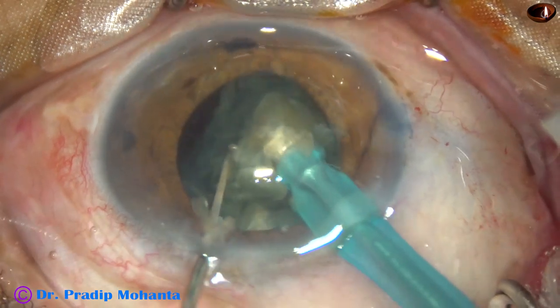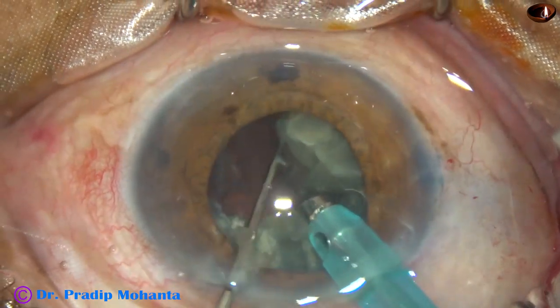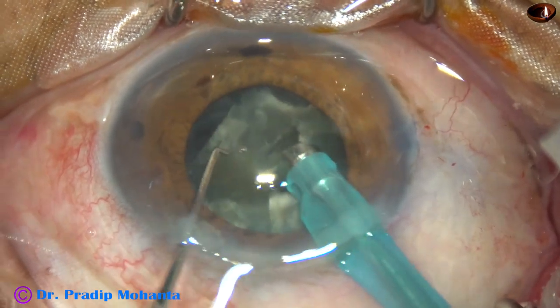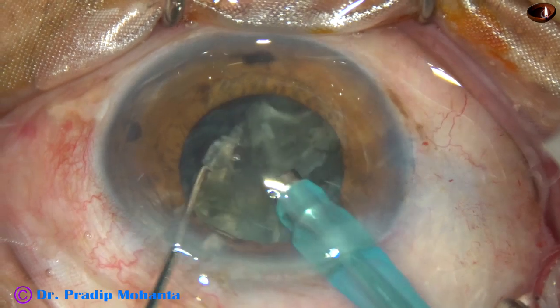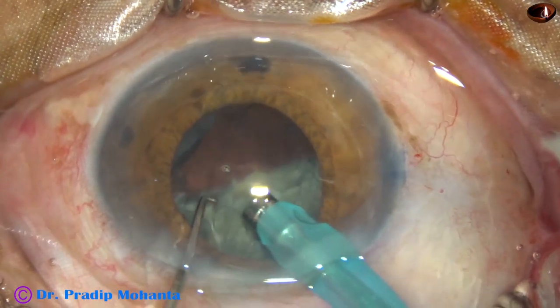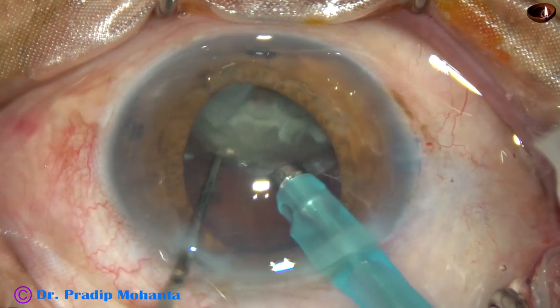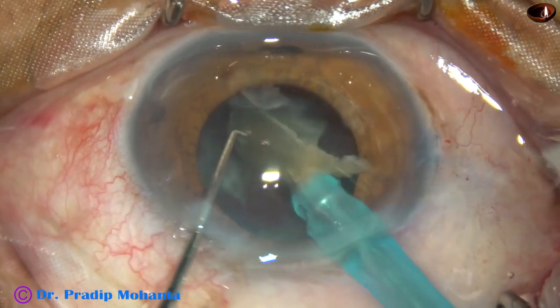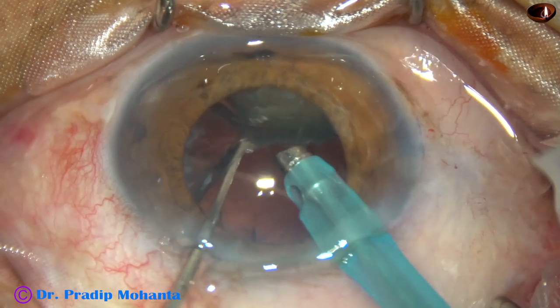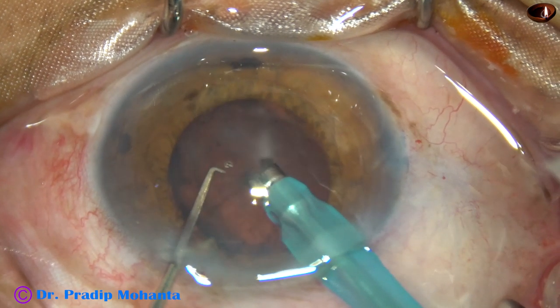Now each quadrant is tilted and emulsification of each quadrant is started from its apex. If necessary, these large nuclear fragments are subdivided into smaller parts, though most of the time it is not necessary. There is no hard and fast rule in surgery — whatever is safe for the patient, by whatever technique you are getting good results, whatever your intuition says for the well-being of the patient, do that.